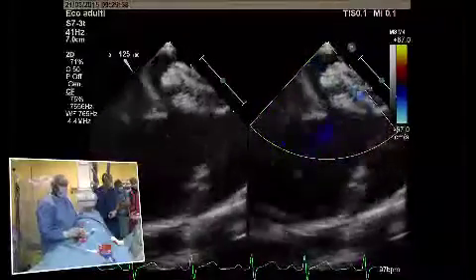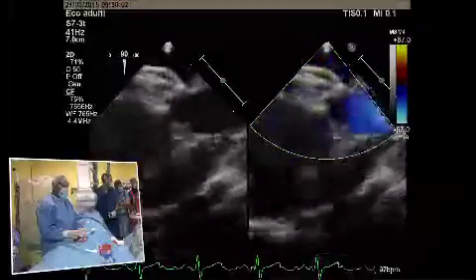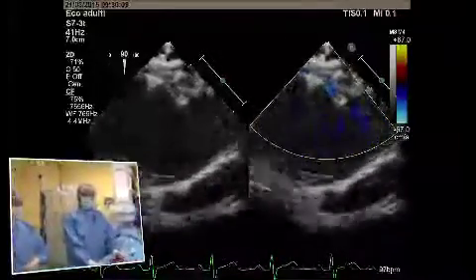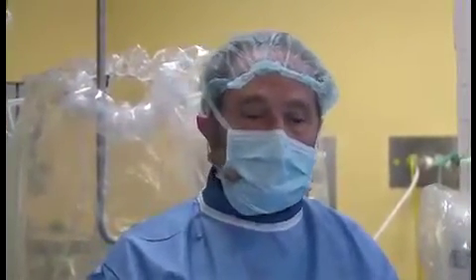Yeah, that's right. The cable can get unscrewed. Yes, we've been very quick, so I was not very worried about the possibility of unscrewing the device, but you're absolutely right. When you cannot get a good position on the device and you have to do several manipulations, I agree with you that it's very important to be absolutely sure that the device is securely stuck with the delivery cable.